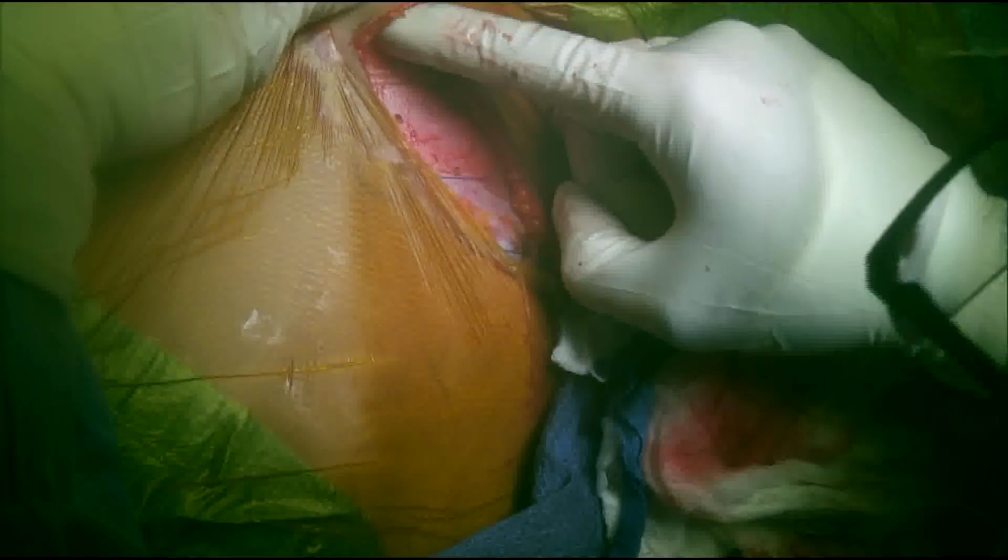After completion of the abdominal pocket preparation and the spinal catheter fixation, a catheter passing device is then inserted, starting from the spinal side in the spinal wound, and it should be tunneled underneath the skin towards the abdominal pocket, as you can see demonstrated here.